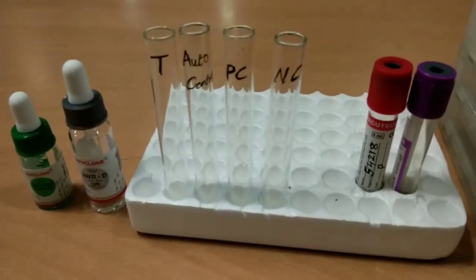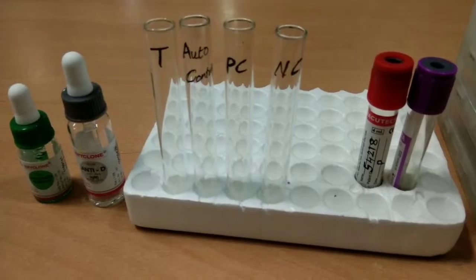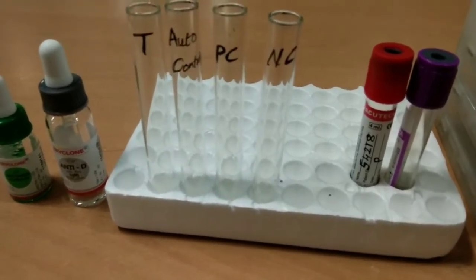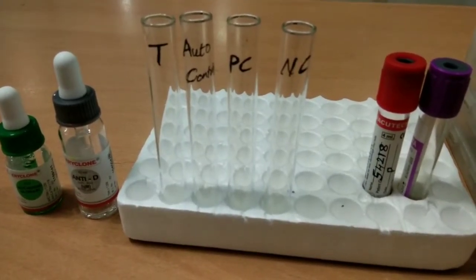Hello friends, today I am going to do the indirect Coombs test. Indirect Coombs test is also called the indirect antiglobulin test. This test is used to detect incomplete or unexpected antibodies in the patient serum.